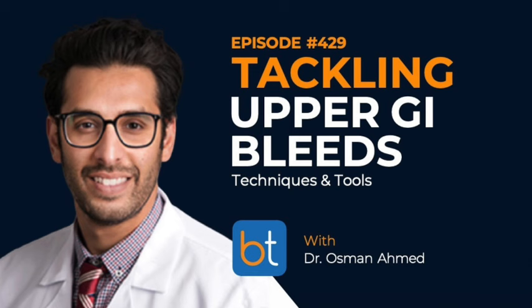Yeah. So we already talked about pre-procedure imaging, but let's say like you said, it's a peptic ulcer and you're probably going to be going after the GDA. Just walk us through your procedure. Yeah, for sure. Pre-procedure, like we mentioned, hopefully the endoscopist has placed some clips or something that we can fluoroscopically identify.